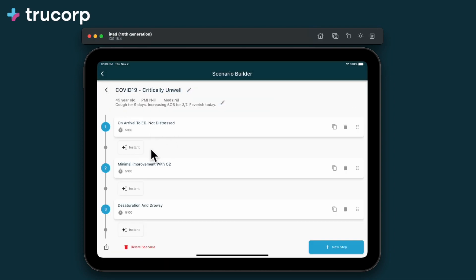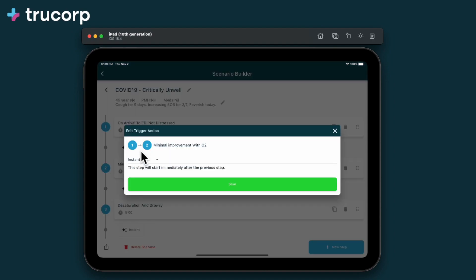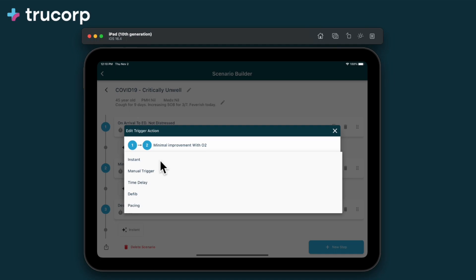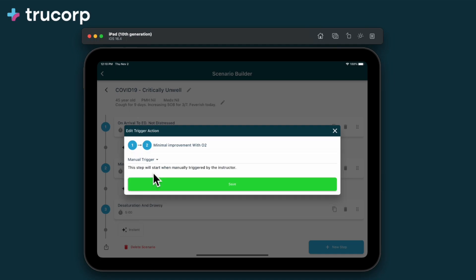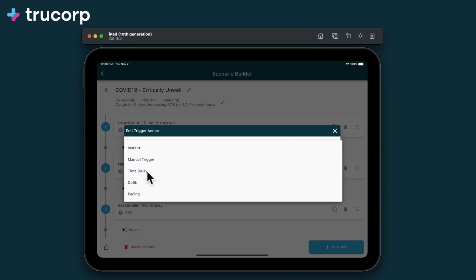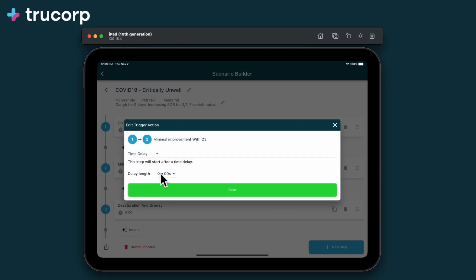A trigger defines when the next step starts. You can choose from Instant, where the next step starts immediately; Manual Mode, where the instructor manually activates the next step; or Time Delay, where the flow continues after a set time.